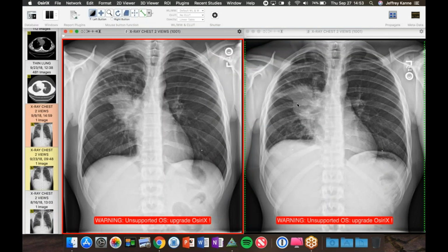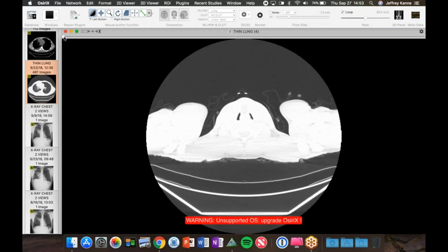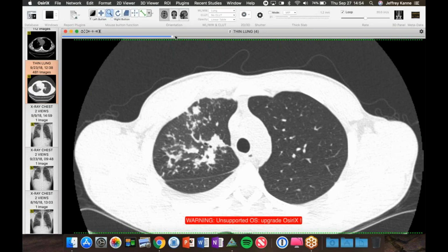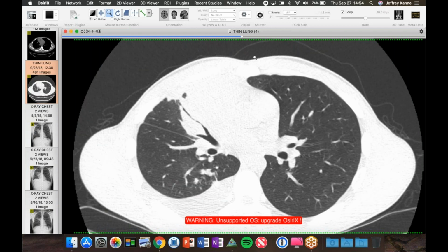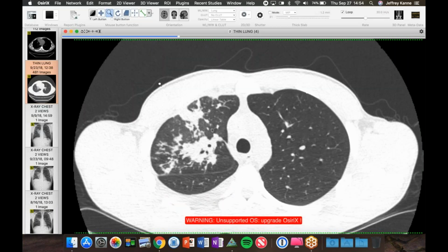So kind of moving over the course of 5 weeks. So moving a little fast for mycobacterial disease. Does have pleural effusion at this point. So they did a CT scan. I'm not sure how much that really added because it just kind of confirms the abnormality. But there are all these nodules, and we can see some are centrilobular, airway centric, tree-in-bud, and then this more confluent consolidation around the right upper lobe, and then some extension into the right lower lobe, and a small layering effusion. There's no lymphadenopathy and nothing else.